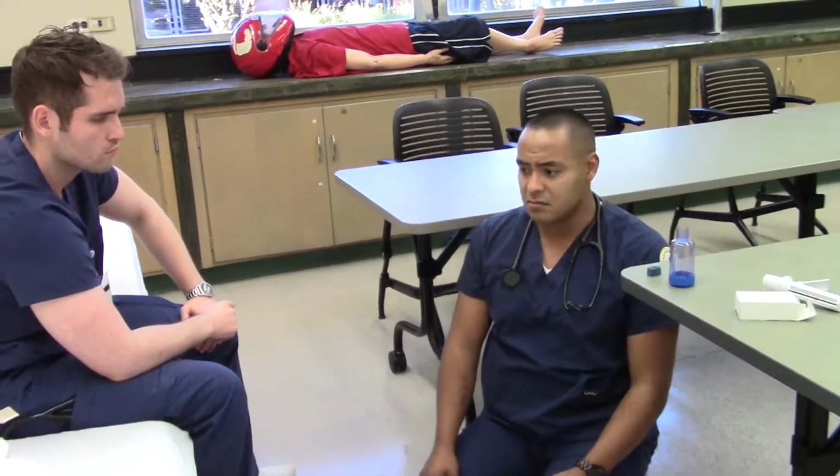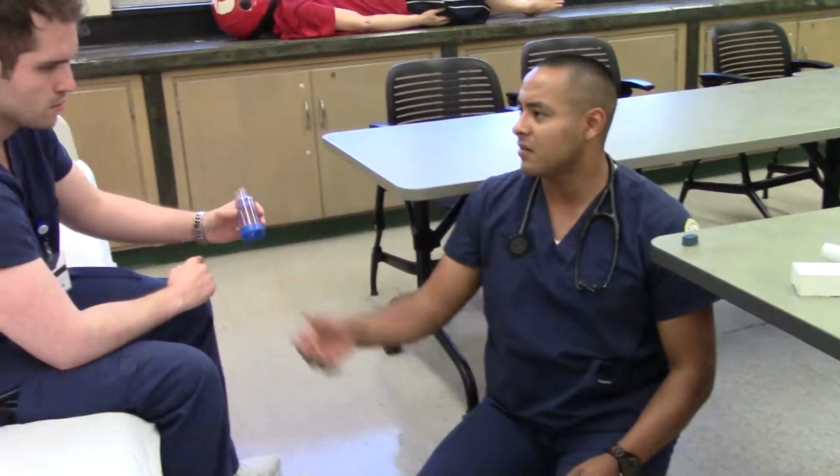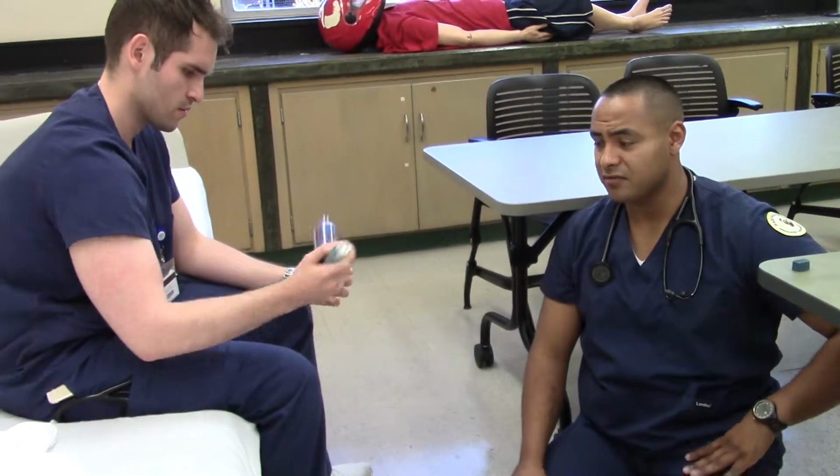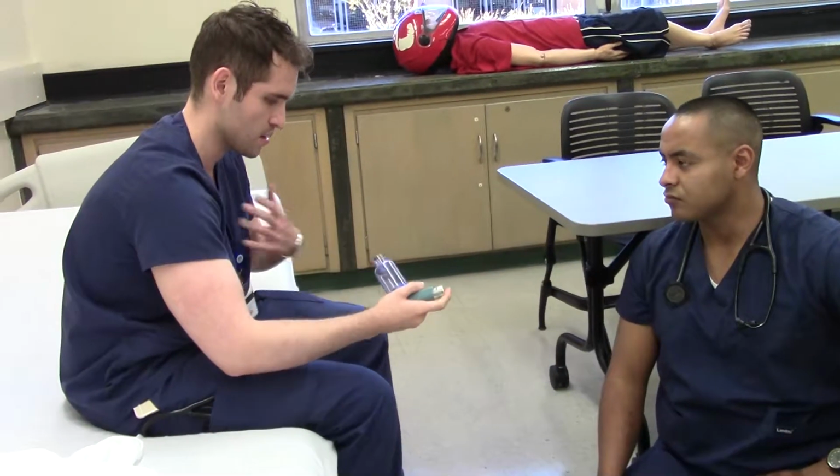So great, I explained it to the patient. Want to explain this to me, I guess? Sure, go ahead. You see what that was? Yeah. So I just pop it in, make sure it's checking. Yep. And then once I press it, it stays in there, and then I wait to inhale.